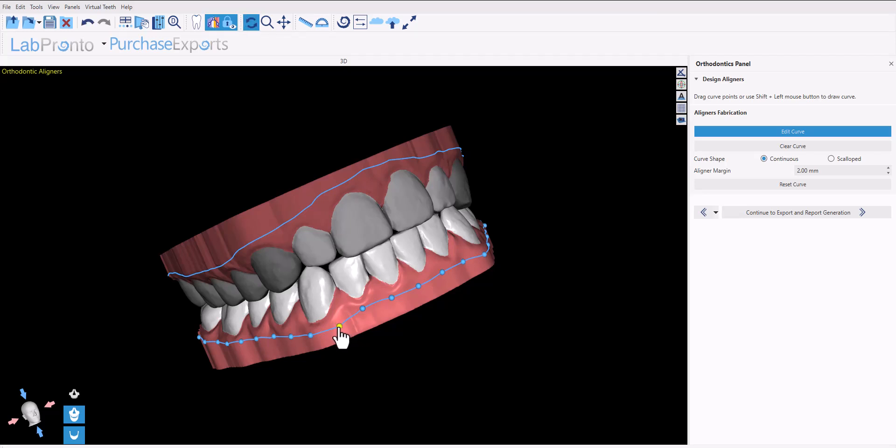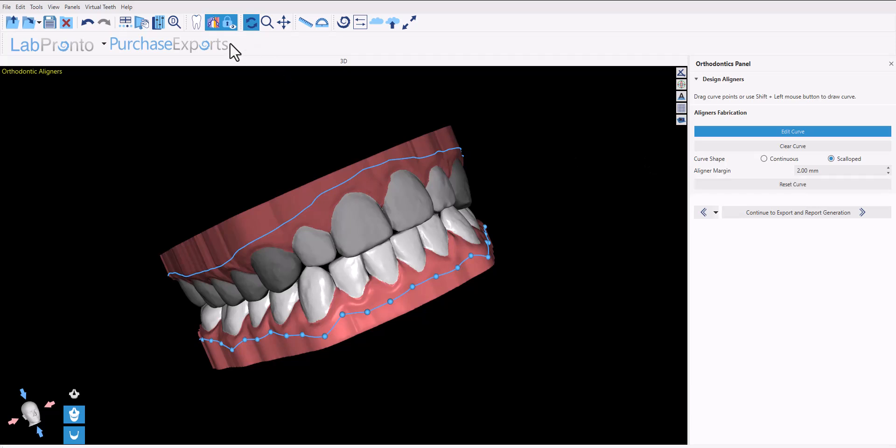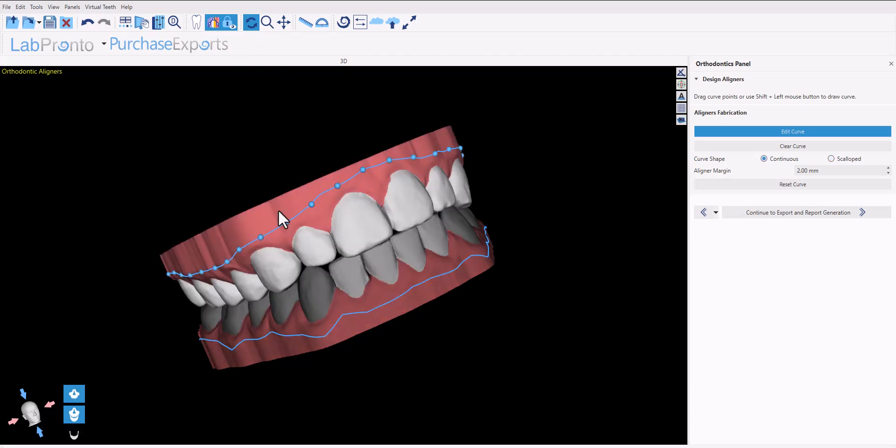If you'd like to switch from continuous to scalloped, simply click the relevant radio button and click 'reset curve'. Go ahead and left click on the opposing arch, scalloped, and reset curve.